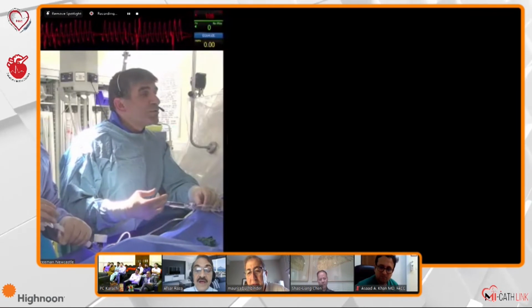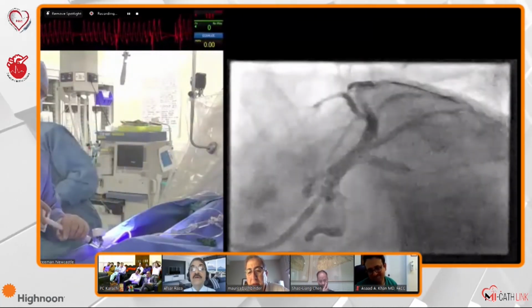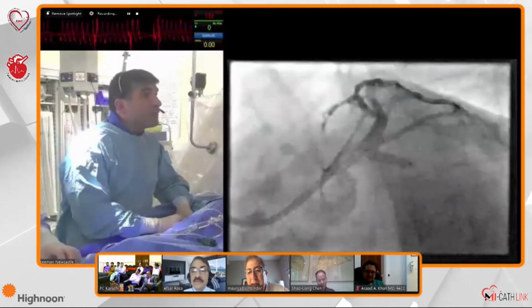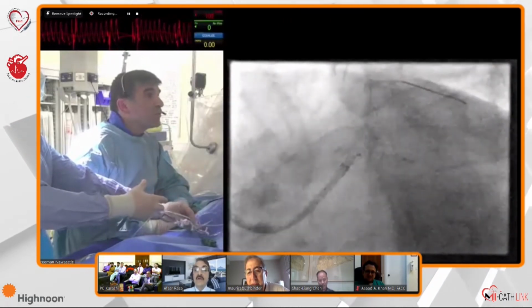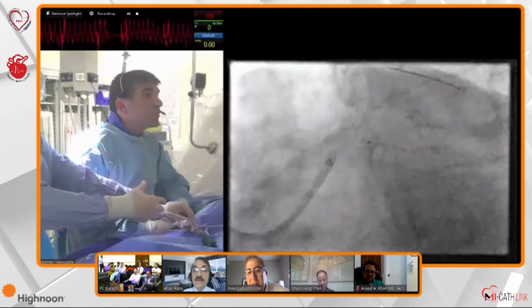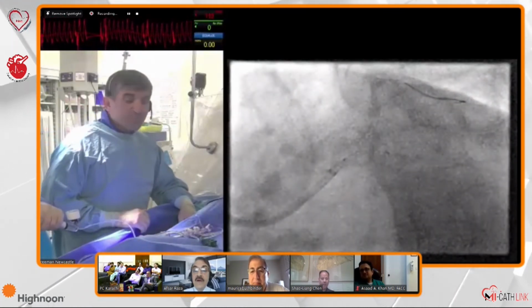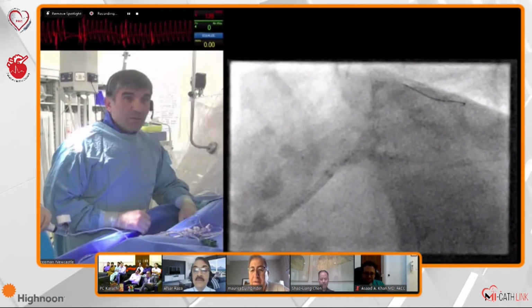Okay. So when I inject here, store that. Okay, down. And dilate here. And I'm going to have a 5.5 by 20 non-compliant balloon. Okay, go up there again. 12. Beautiful. Store. Well, we are almost finishing.